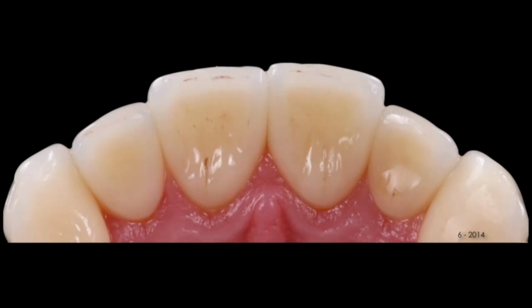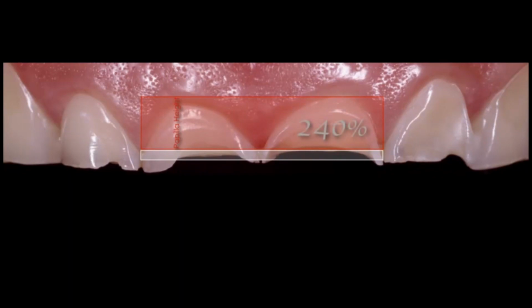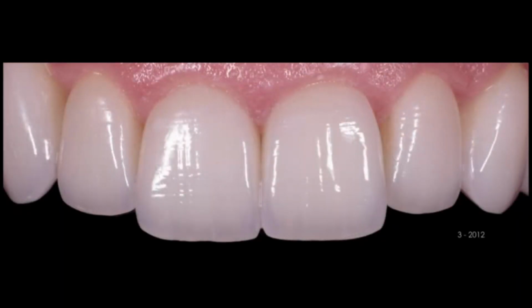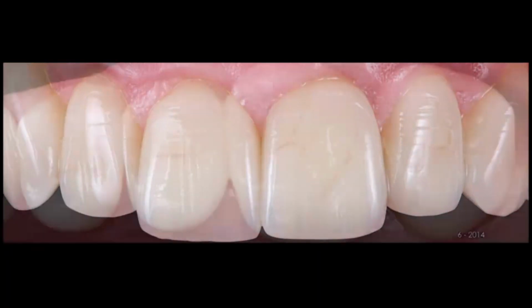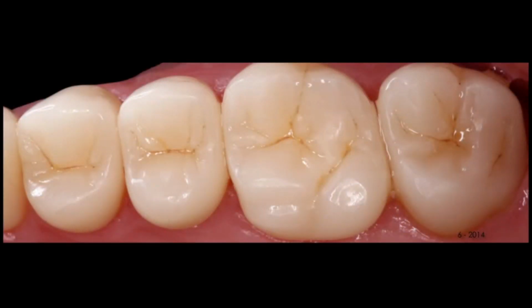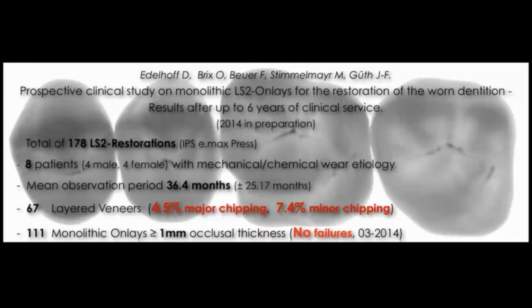This is the situation after almost 3 years, the same from the anterior view. Look at the relation between papilla height and the width to length ratio. We came from here, we have this situation now, and then again about 2.5 years later. This is the situation for the posteriors, 2012, 2014. It works, and again we can see, like in the other patient, that we have some wear facets. I show you this picture only to really convince you that this material works nicely.